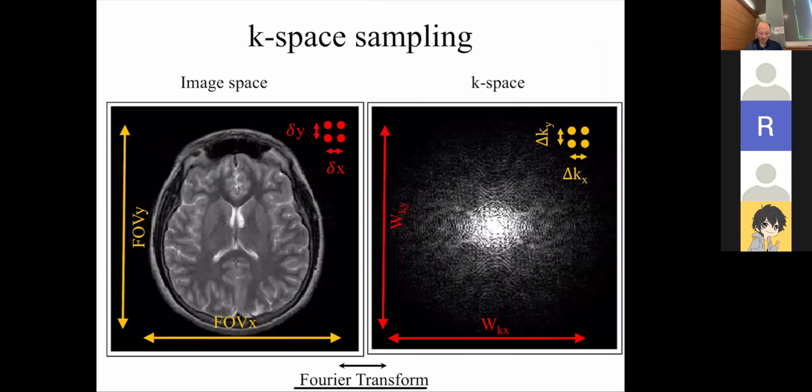Okay. And your job, if you so decide, is to come up with better methods so people don't have to wait so long. That's what MRI people are always trying to do: how do you go faster? We're going to spend the next few lectures talking about that. We'll start off with the very basics, and then get as close as we can to state of the art, like deep learning, and talk about how that can allow things to go faster.